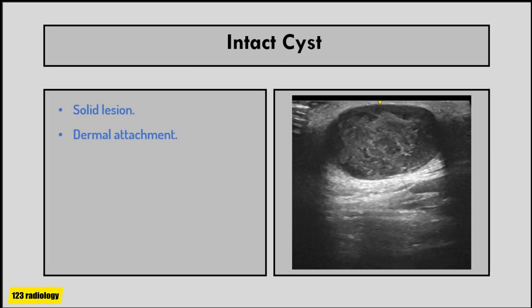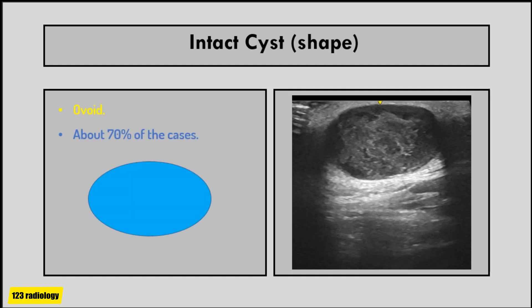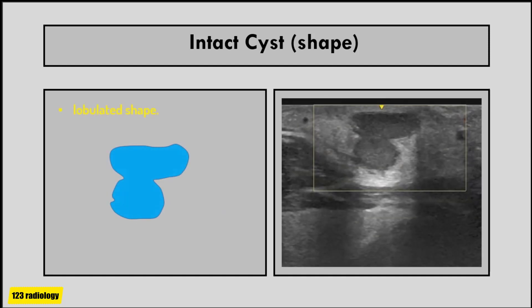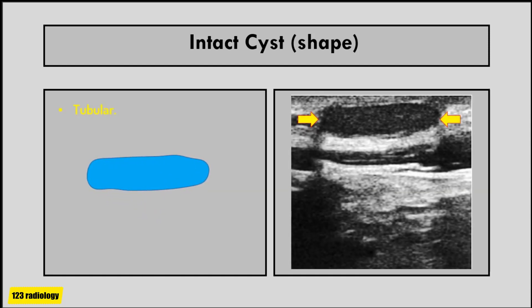Epidermal inclusion cyst most of the time appears as a solid lesion with a dermal attachment. The shape of an intact cyst can be ovoid, rounded, lobulated, or tubular. Ovoid shape is the commonest, seen in approximately 70 percent of cases. It can be rounded with well-defined margins, or have a lobulated shape, or it can be tubular as seen in some cases.